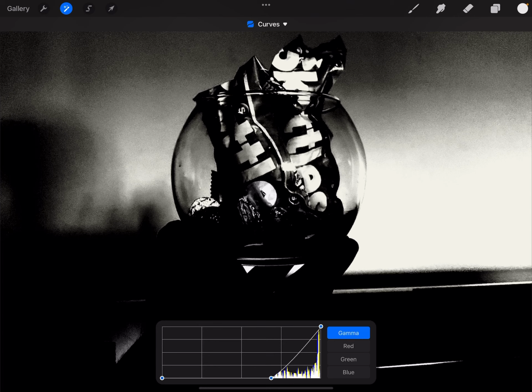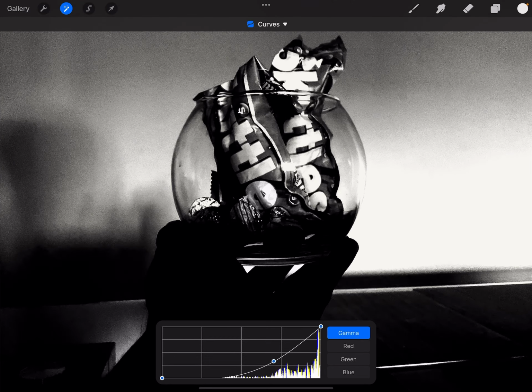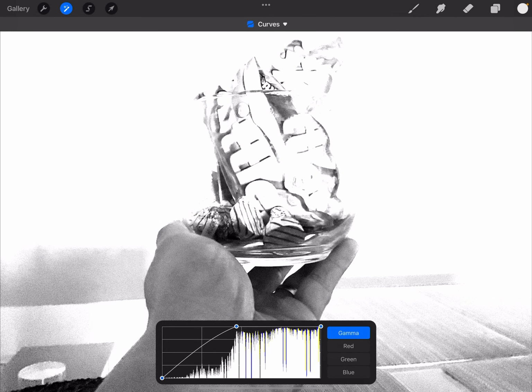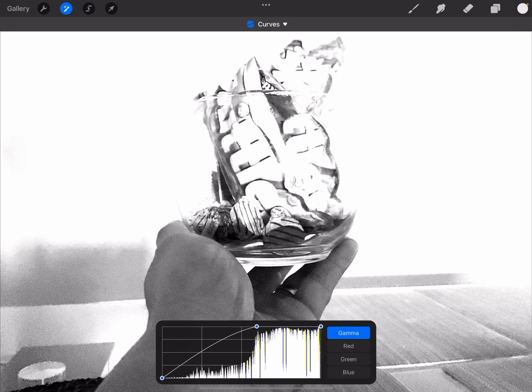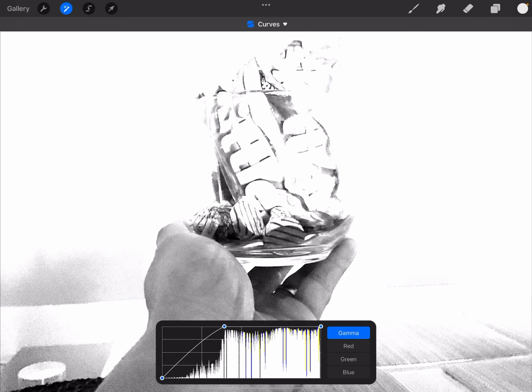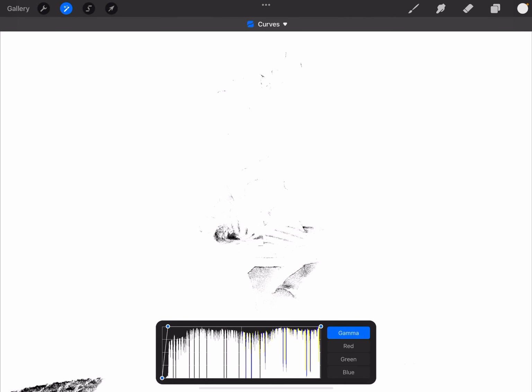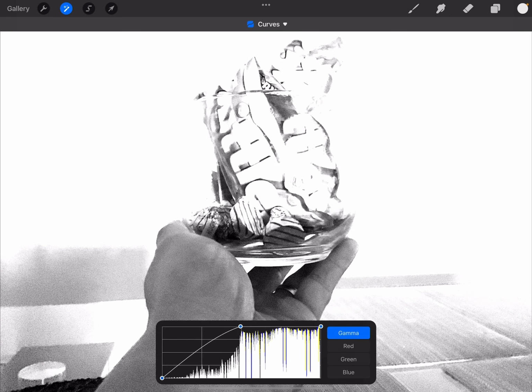The quality of the image is controlled by kVp. As we increase kVp, we can see more image details coming through. When we see this white stuff hitting the image, we can attribute that to more photons hitting the image receptor. So if we use a high kVp and high mA, our image is just going to look white like this. The reason is that all of the photons are just passing through the body and hitting the image receptor. So you want to find a balance between the two.